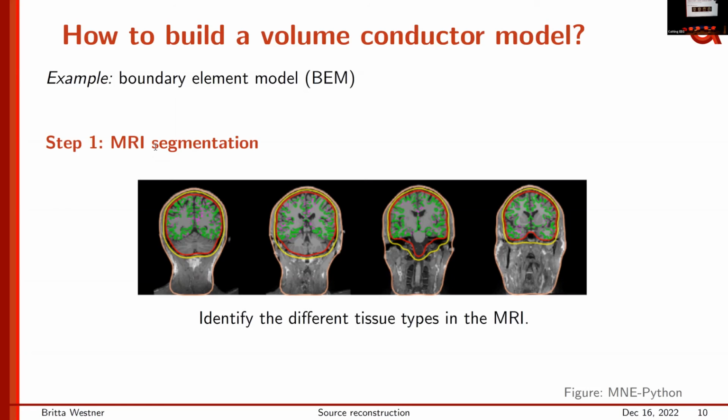For ICA, I don't think it's that big of a problem. If you are 2-3 components short, you just have to remember that you might have to do something about it. For example, regularizing or using a truncated inverse. There, I wouldn't bother with reporting different sensor data or using different data for your sensor than your source.